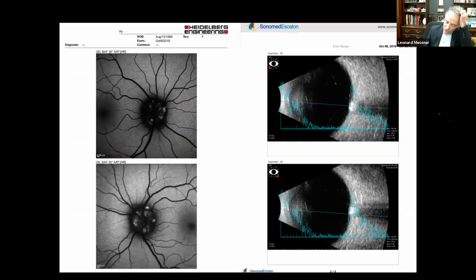So looking at both B-scan ultrasonography as well as fundus autofluorescence, well, most of us or many of us were trained to get B scans looking for buried drusen. And here you can see this very demonstrative hyperreflectivity. But I'm going to caution you with that because in order to get that hyperreflectivity, you need to have significant hyalinization or calcification, which is why in younger individuals, younger patients, if the calcification is not there, you may not see this robust hyperreflectivity on B scan.